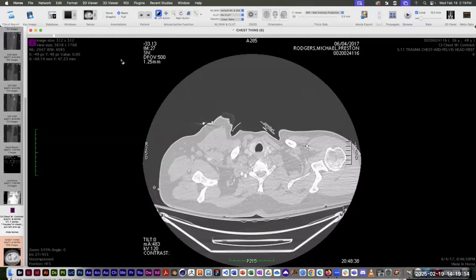But I started looking at the model that I had and then looking at the written records that I had and realized that everything was backwards. It said that he had fractures of the transverse processes on the left. I'm looking at the model and they're on the right. And there was some other detail that was on the left that I'm looking at the model and it's on the right. Everything was backwards. And so I came to a realization and then later looked up, in the, there's not really a Horos manual, but you can find information online about it, that negative sign makes a difference.